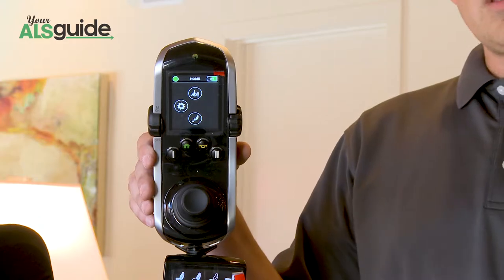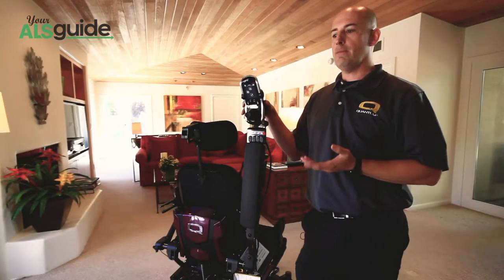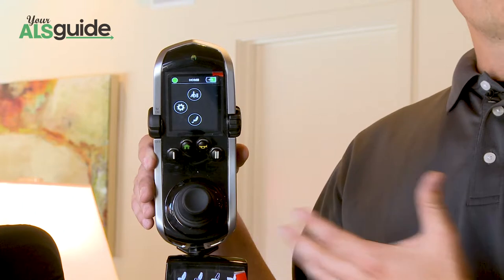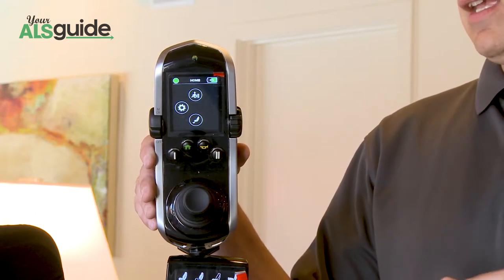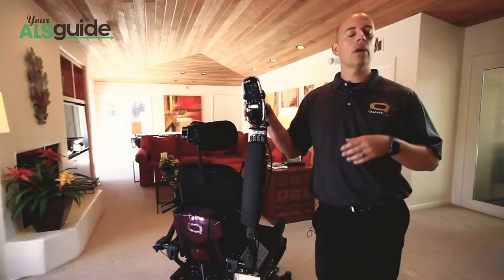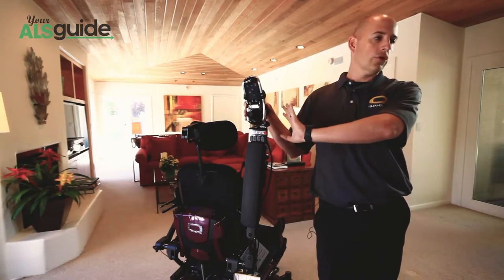So Bluetooth. This is something that is, I feel like, a game changer for a lot of patients, because when you start to lose access to your joystick, when you switch to a head array or a light touch joystick, something of that nature, typically now you're not able to use your phone, use the touch screen on your phone, and we want you to be able to do everything that you could before, and now you can access it through your chair.